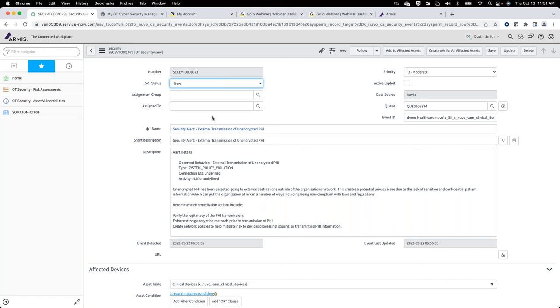One of the areas that would give me pause is that we did a lot of overnight pump rentals. They often weren't checked in by healthcare technology management, and they're still going to get connected to the network and leveraged as needed, as it's an overnight rental, but that was never in our system. Armis would catch that, and I need to have a business process or policy in place to handle it so that I'm not sending a tech every morning to hunt for these rentals.